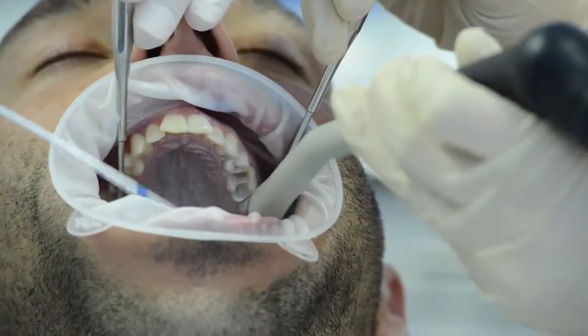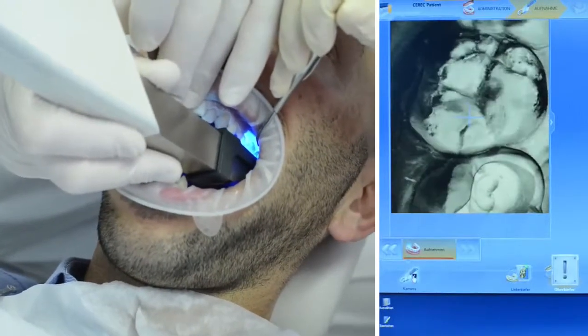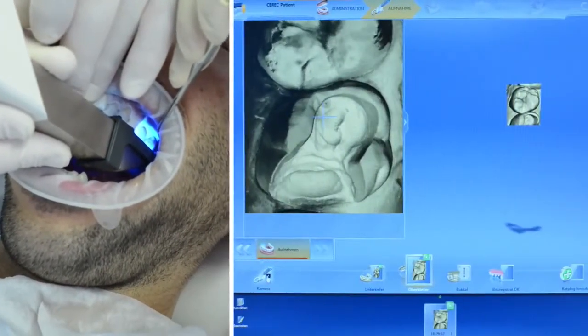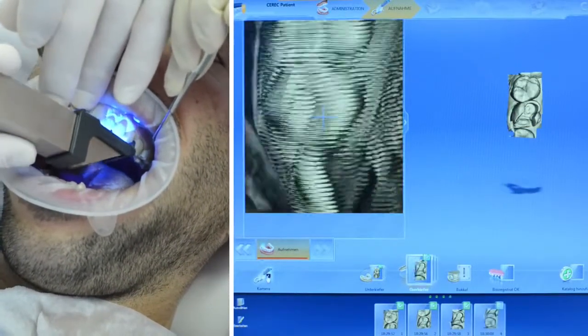With BlueCam, powdering and scanning follows the preparation. The camera can be rested directly on the tooth for each exposure to increase stability. The built-in shake detection system ensures images are captured only when the camera is held absolutely still.